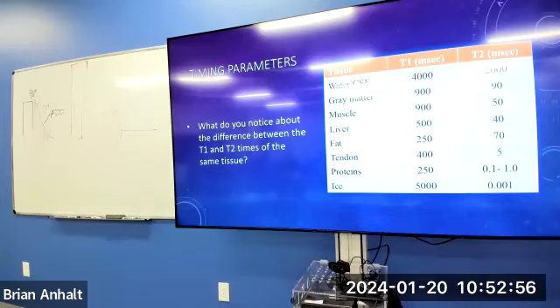Well, the things that the AI helps with right now are basically just image quality improvement, right? So your scan times are gonna get quicker, or you can take that and just make better quality images. The AI denoises and sharpens images, and it's FDA approved now, so it works. AI also helps with planning, like planning certain angles through the brain, through the IACs. The AI can recognize it and plan it for you now. It can also help you strategize your sequence, since there are different strategies you might need to take.